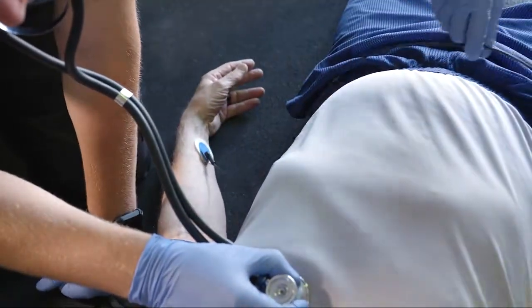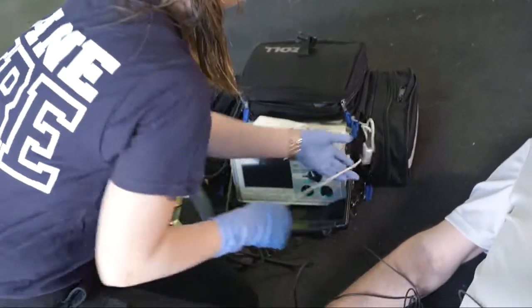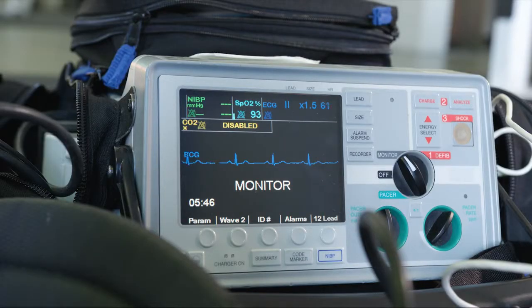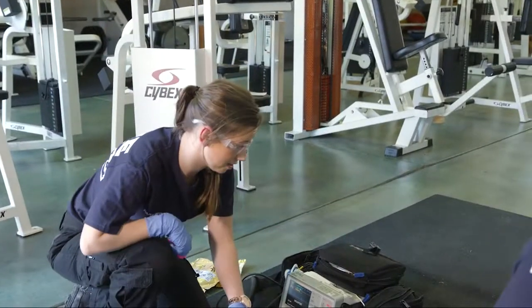As an EMS responder, you can improve the likelihood that your patient receives the proper treatment at the most appropriate facility by reviewing the basics of 12-lead ECGs. All right, so we're going to give you some oxygen, hopefully get you feeling a little bit better, okay? Gonna have to cut your shirt off, okay?